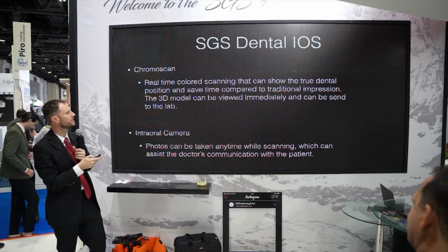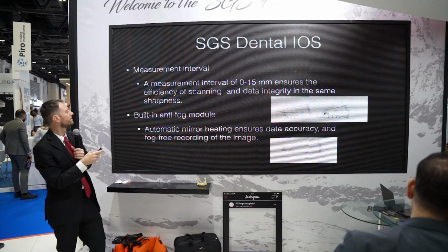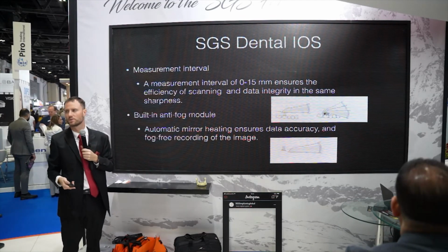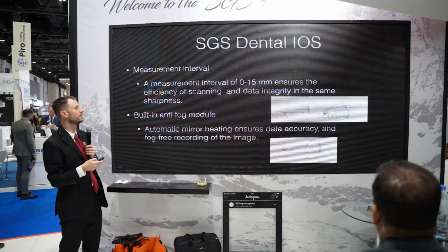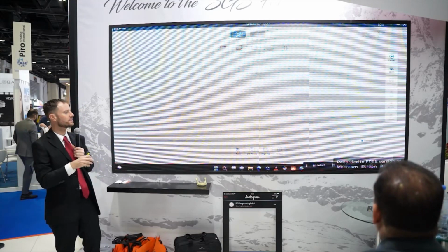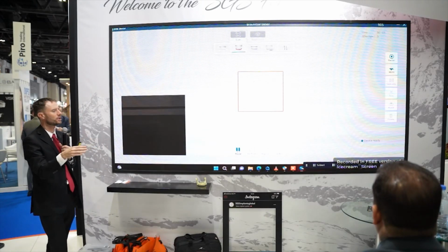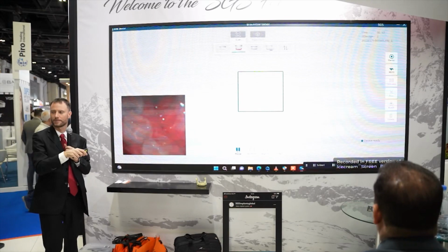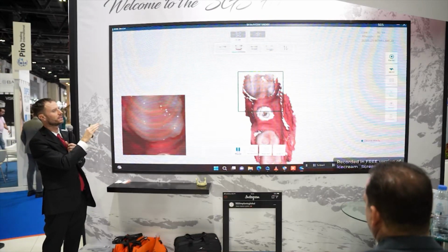I made a short video of how that goes. It has an anti-fog module, but I think today most of these have it, because patients exhale and that really disturbs us. This is really live timing. I didn't modify anything. I just switched on. It takes a bit of time until it finds the first situation. You go to the patient, you need to find the first stage, and then it really quickly goes.